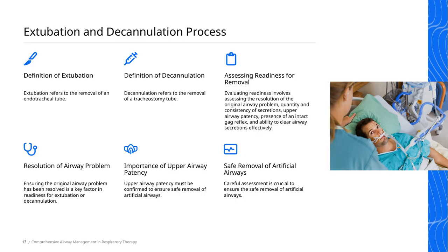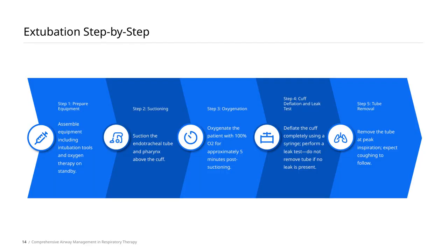Both procedures require careful evaluation and timing to ensure safe and successful airway management, which ties back to our overall goal of maintaining patient safety throughout respiratory therapy. All right, let's walk through the extubation step by step to ensure we do this safely and effectively.